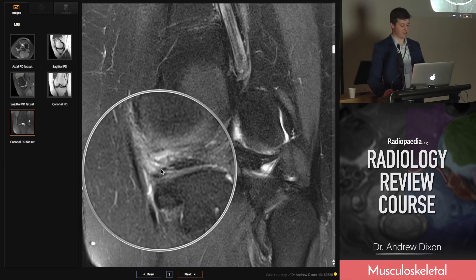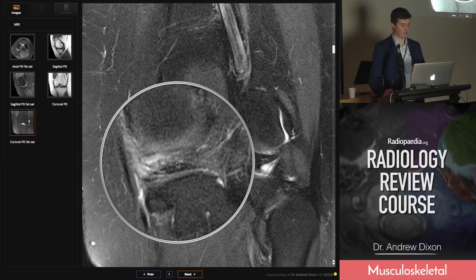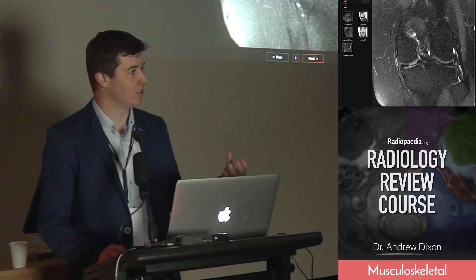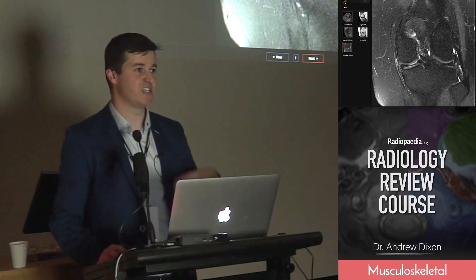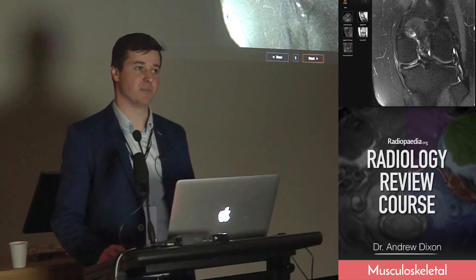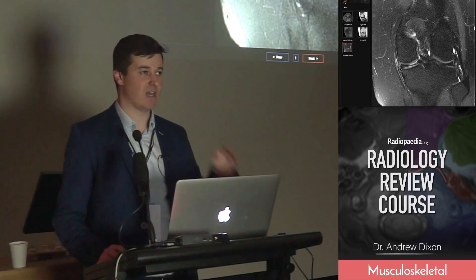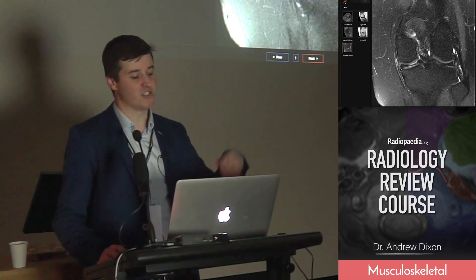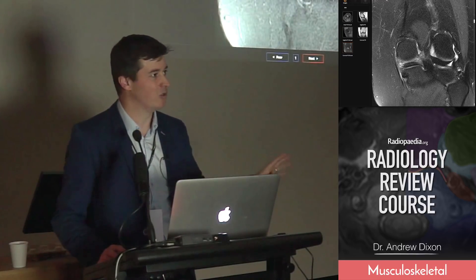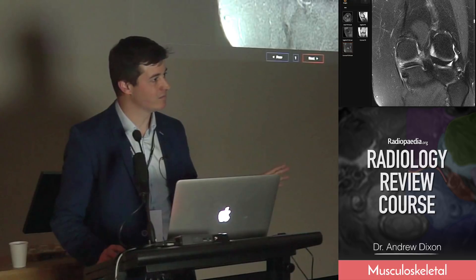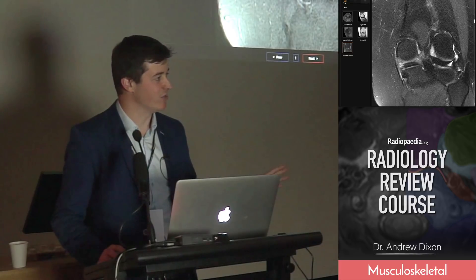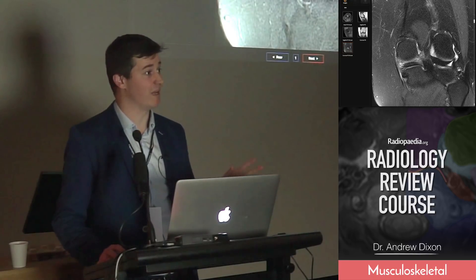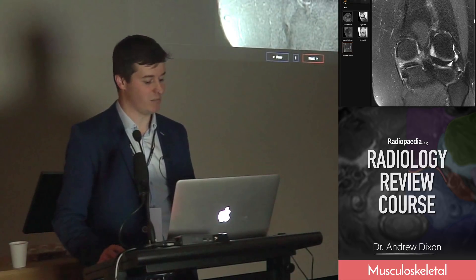On the coronal plane you can see all this stuff sitting next to it — it's important to report that. You should say there is associated localised synovitis, because that suggests the tear is symptomatic. If you have a degenerative horizontal tear with no synovitis next to it, maybe it's not causing their knee pain and doesn't need treatment. But if there's localised synovitis, it probably makes sense that it's causing pain.